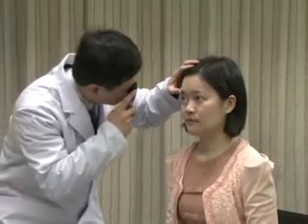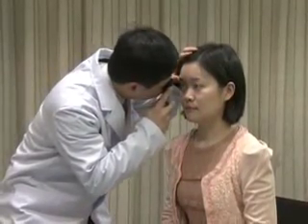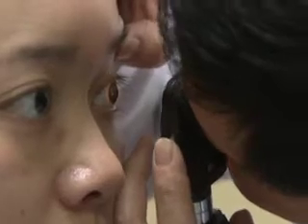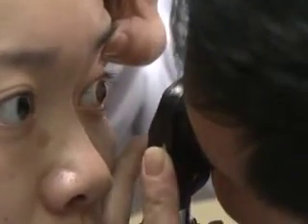Follow the red reflex as you gradually move closer to the patient. Turn the dial clockwise to decrease the diopters until you focus on the retina. Hold the ophthalmoscope as close to the patient's eye as possible, since this will optimize your view.